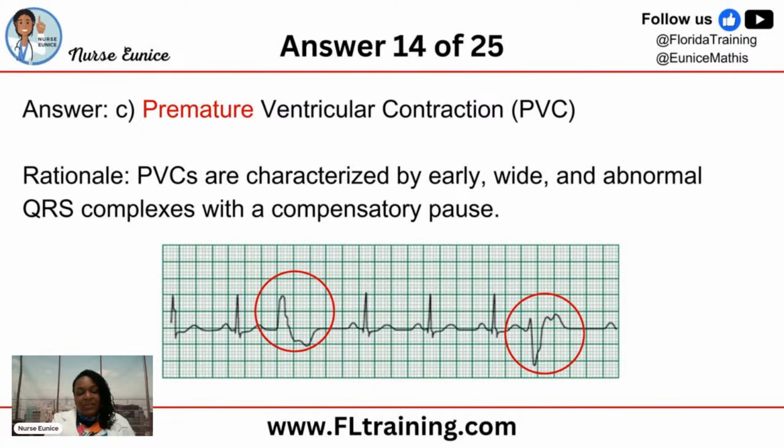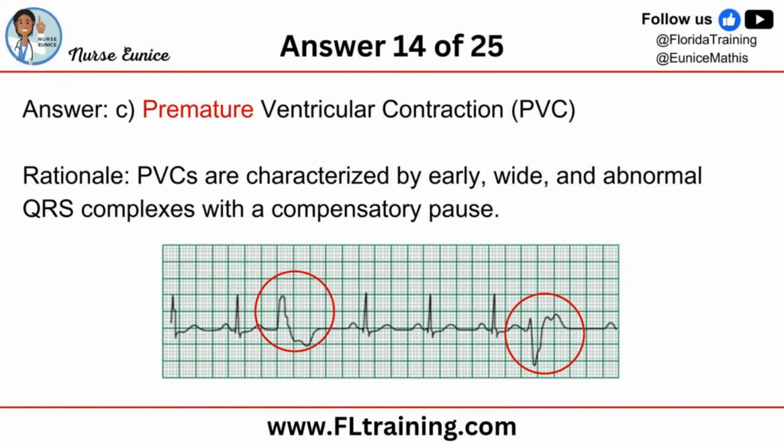The patient's going to be fine. They should be okay. But if you start seeing more and more PVCs, it could be a sign that their labs are abnormal, that their medications may not be therapeutic. And so you would want to, if you're a CNA, notify your nurse. If you're a nurse, you want to, of course, call the doctor, who will then order a 12-lead EKG. But a PVC every now and then, your patient more than likely would not have any symptoms.